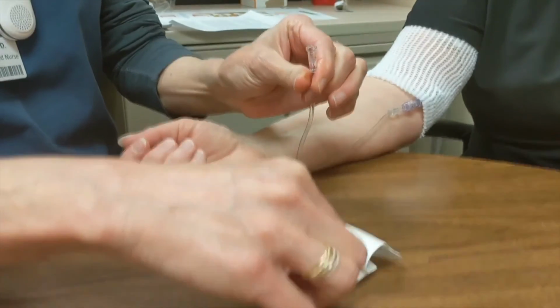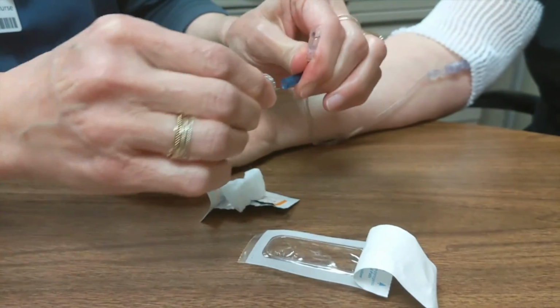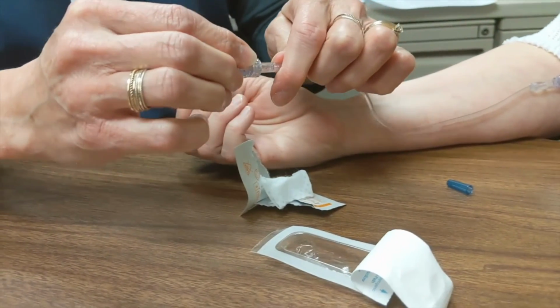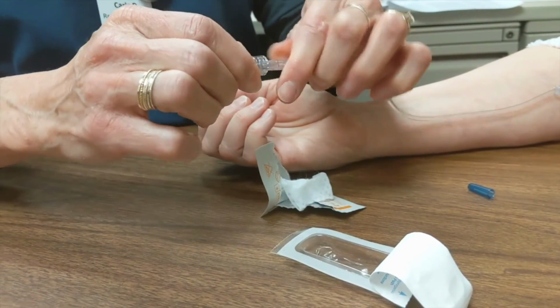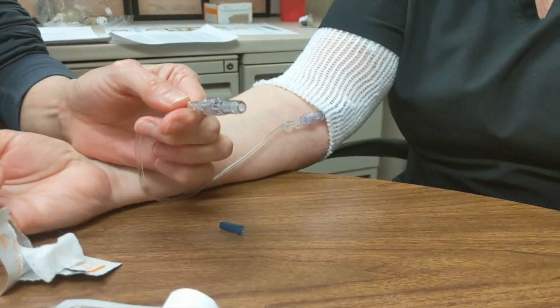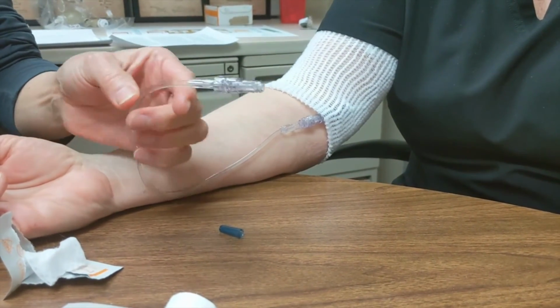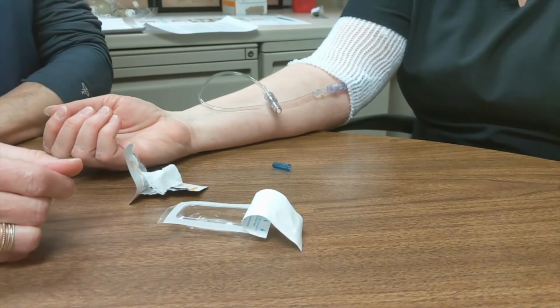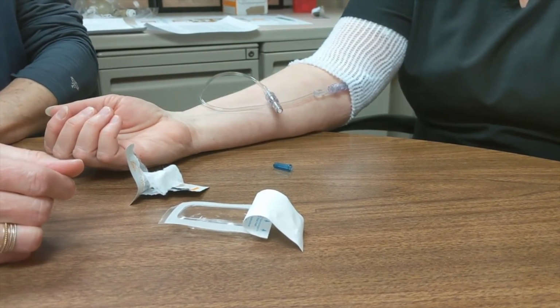Untwist the blue protective covering from the new clave, being careful not to touch that area or the end of the line that you cleaned with alcohol. Twist the new clave onto the end of your line. You are now ready to reinfuse your medication. If your clave connector needs to be changed for any reason or you have any questions, please call for instruction.